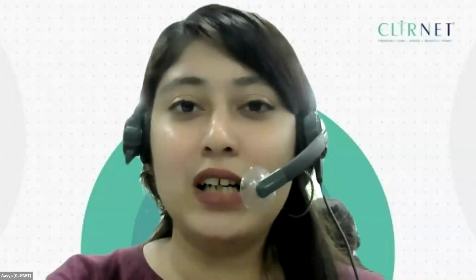The topic of today's session is early ultrasound markers to predict adverse outcomes in the first trimester. I would like to give you an overview of today's topic before we start the session. Early ultrasound markers in the first trimester are valuable tools for predicting adverse pregnancy outcomes. Measurements such as nuchal translucency thickness, crown rump length, and the presence or absence of the nasal bone can provide early indications of chromosomal abnormalities and structural anomalies.